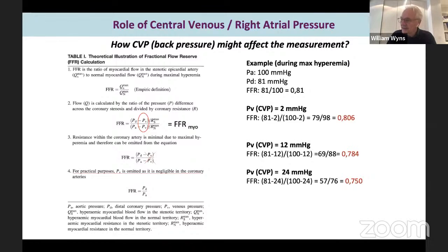If you don't measure right atrial pressure, you're not cognizant of this, you actually underestimate the severity of the stenosis in terms of its hemodynamic behavior. And in fact, you're going from normal to abnormal. Which patient in your practice could this be the case? It would have to be a chronic heart failure patient who can lie flat even though he has very high right atrial pressure because he's used to it, very poor LV.